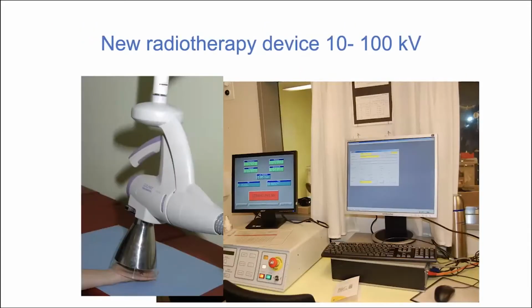You see here an example. So if you use this type of tubus, you can irradiate more or less the full hand. So this would be the setting that we are using for patients with palmoplantar inflammatory disorders.